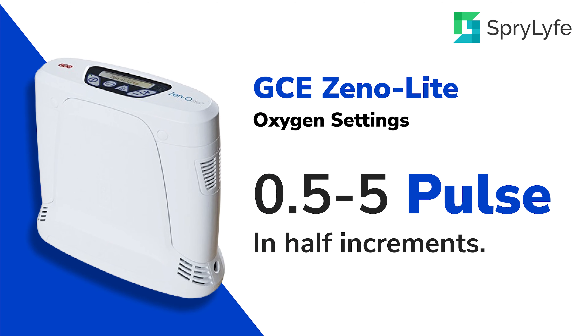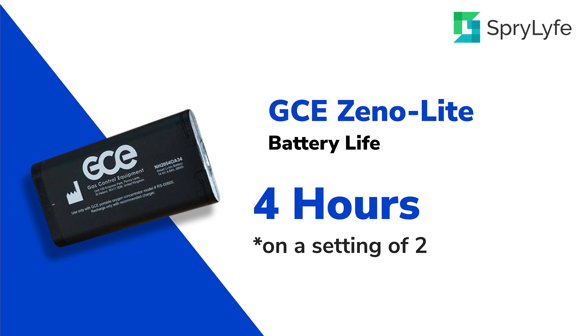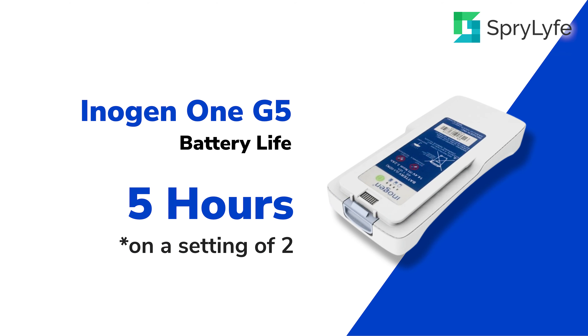The GCE Xenolite settings go from 0.5 up to a liter flow of 5, in increments of half settings. The Inogen 1G5 has a flow setting of 1 up to 6. The battery life for the GCE Xenolite is 4 hours on a setting of 2 away from the car or wall charger. The battery life on the Inogen 1G5 is 5 hours on a setting of 2 away from the car and wall charger.